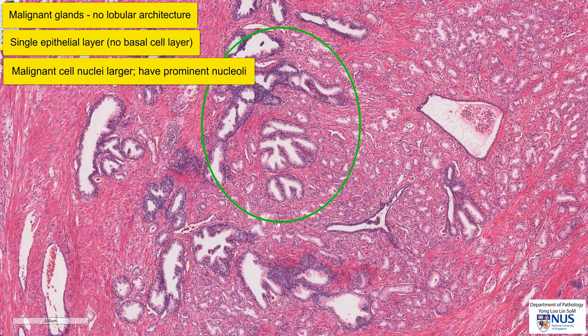So we have malignant glands that do not form a lobular architecture. The malignant glands have relatively uniform nuclei, but they are larger and have prominent nucleoli in contrast to benign glands, and the malignant glands only have a single layer of lining epithelium.